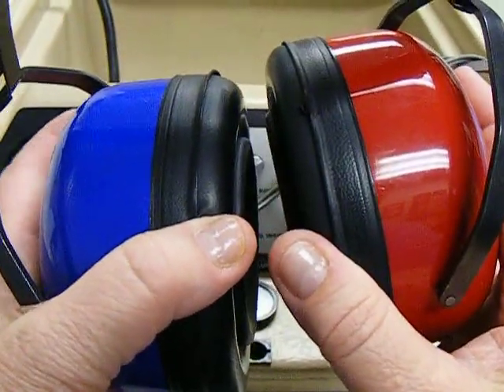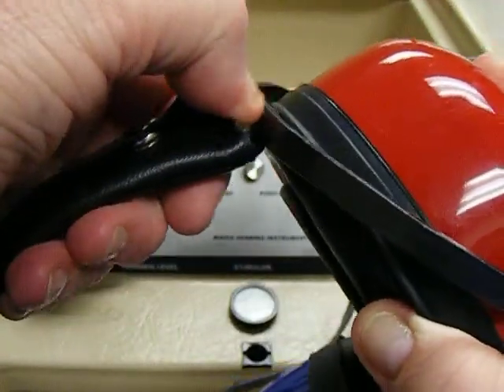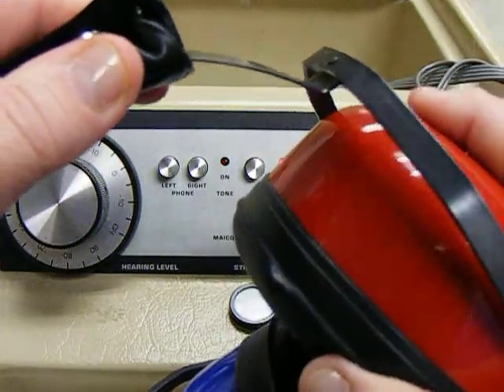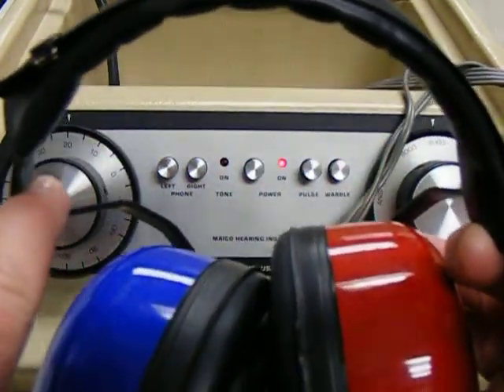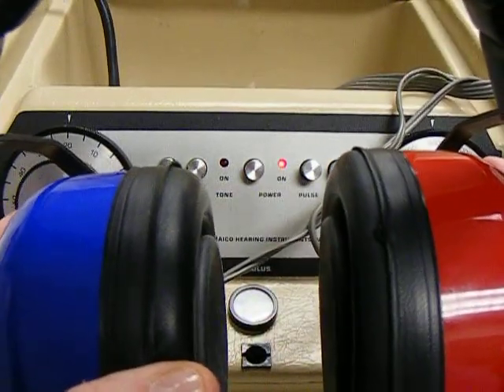Red goes on the right ear, blue goes on the left ear. The earphones are adjustable so you can accommodate different size heads. It should be very simple for you to fit the headband to the top of the student's head so that they fit snugly over their ears.